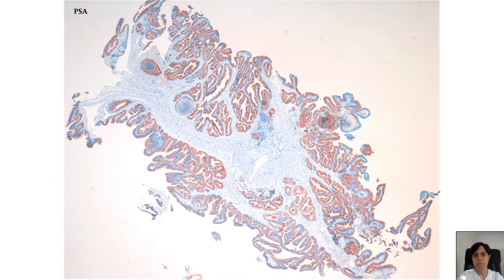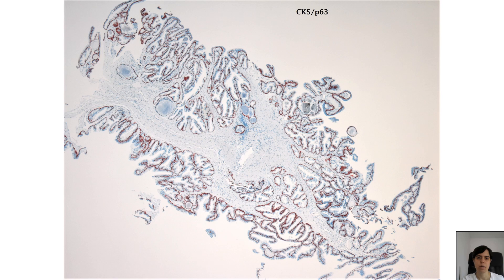PSA, or NKX3.1 if you prefer, will beautifully highlight the prostatic nature of the epithelium lining these lesions. However, you don't actually need to perform stains — this is a purely histomorphological diagnosis. Stains were performed here just for illustrative purposes. PSA nicely highlights the luminal cells of the prostatic epithelium. Basal cell markers such as high molecular weight cytokeratin or p63, or a combination of both, show a retained basal cell layer — in this case in a beautifully continuous fashion — highlighting the benign nature of the prostatic epithelium lining these lesions.